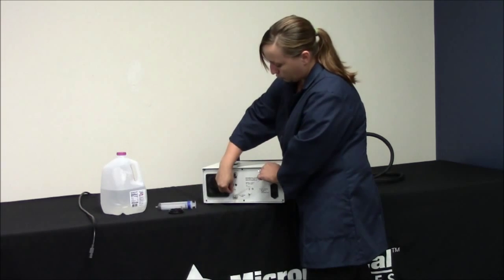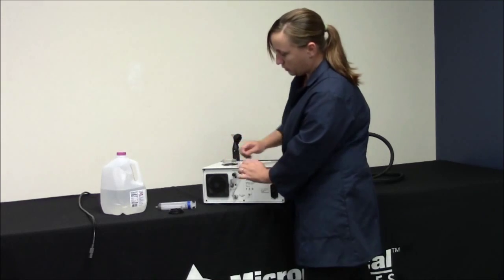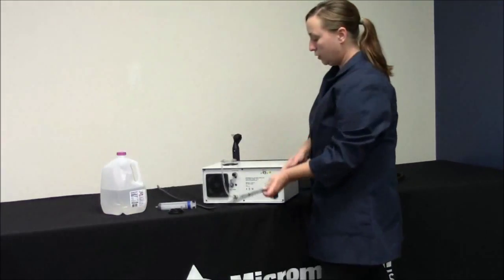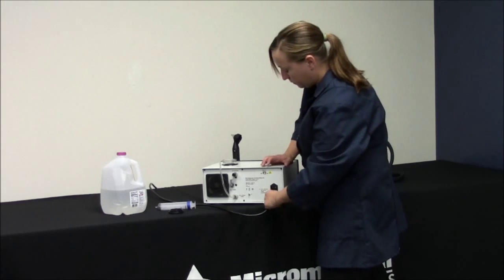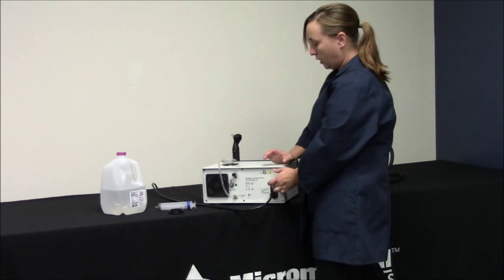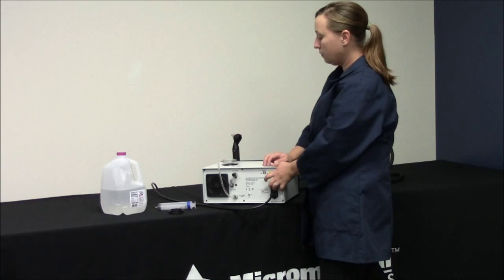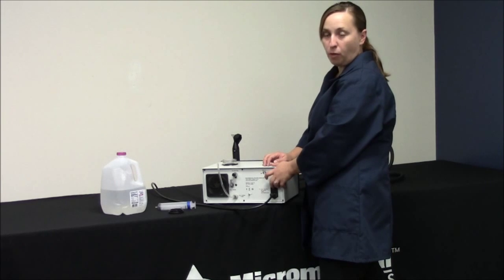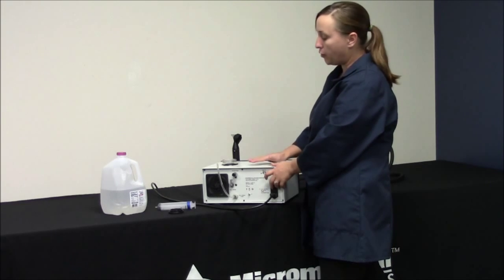Next you'll move the switch up to the run position. You will connect power and you'll turn it on. You'll let the irrigator run for about thirty seconds.